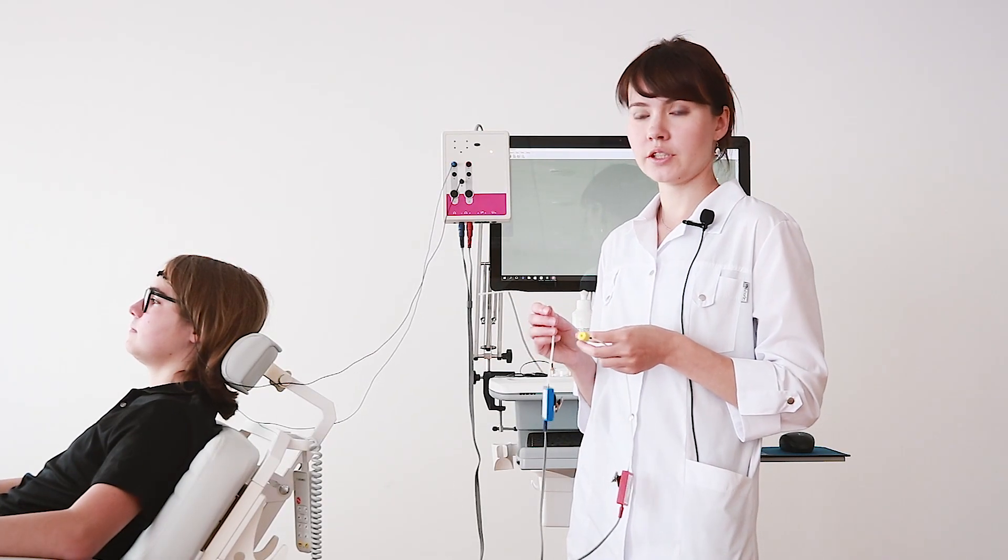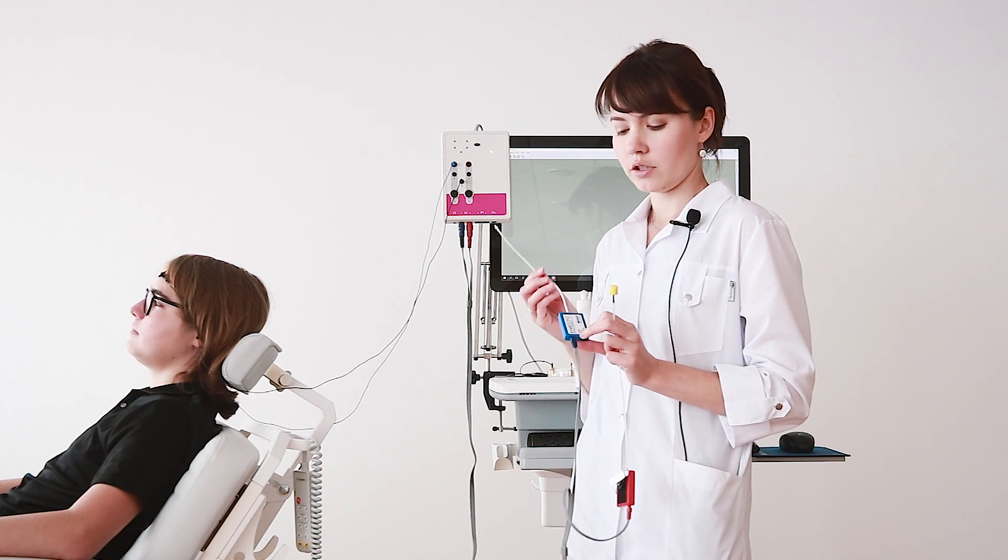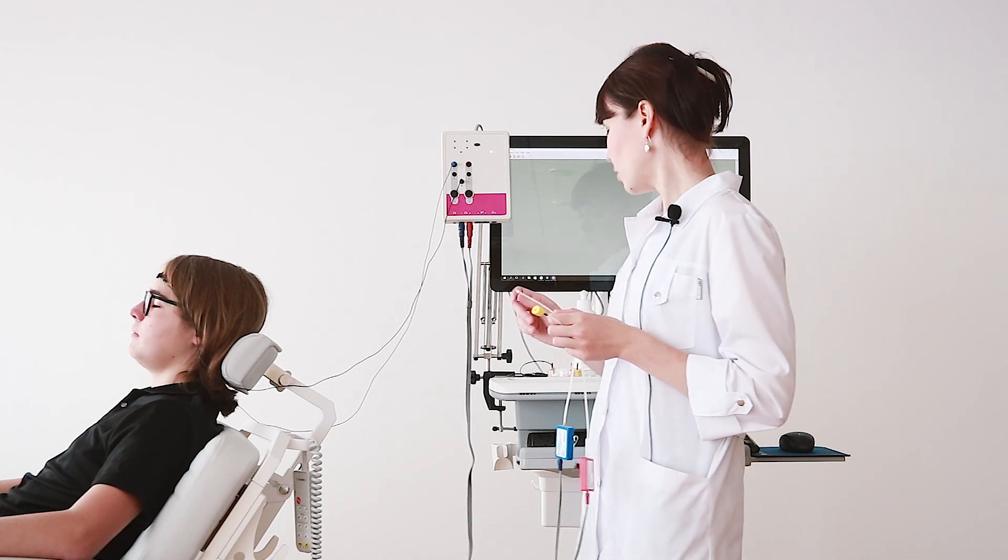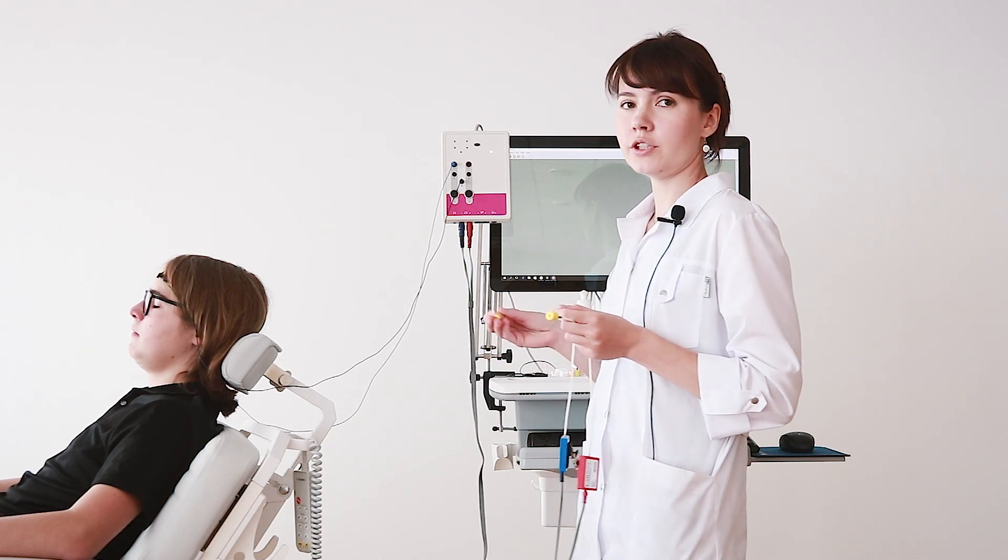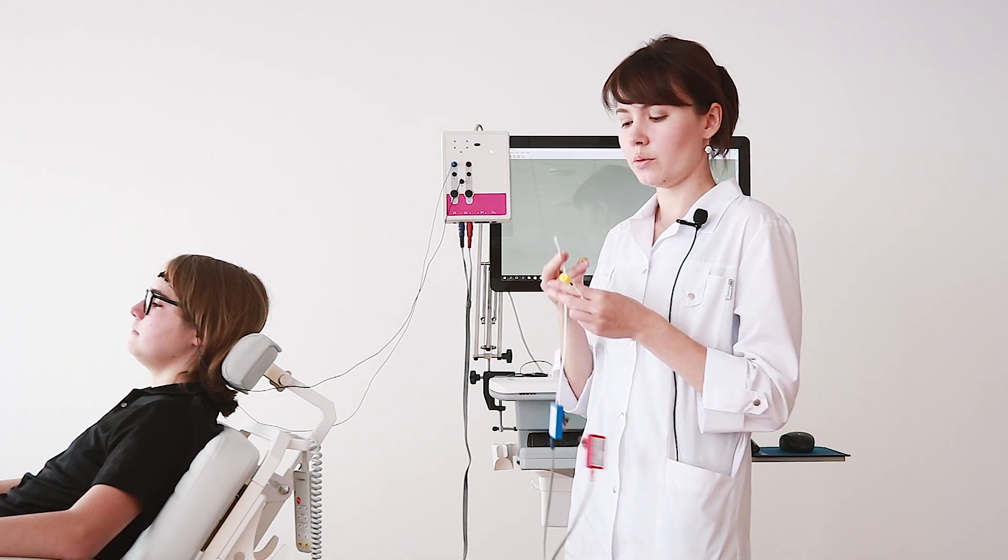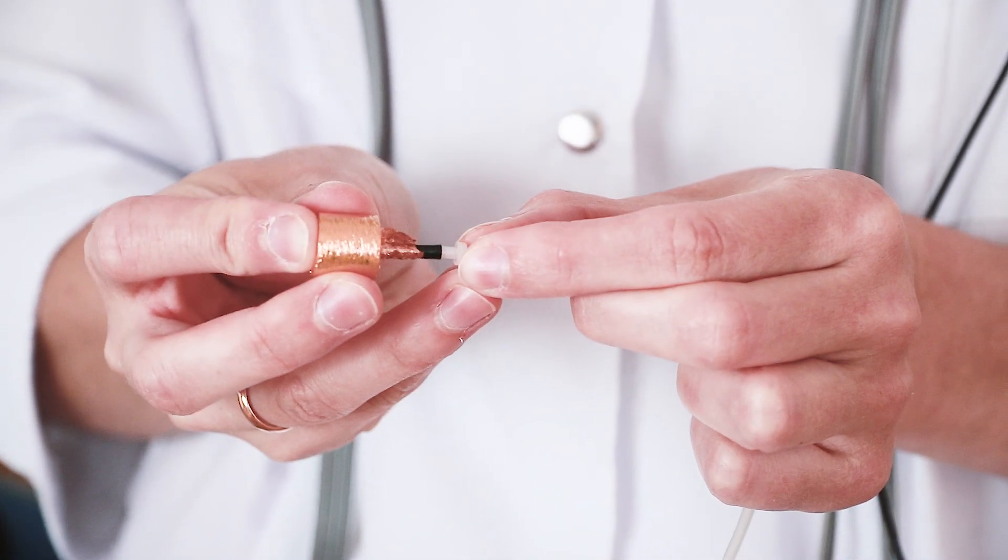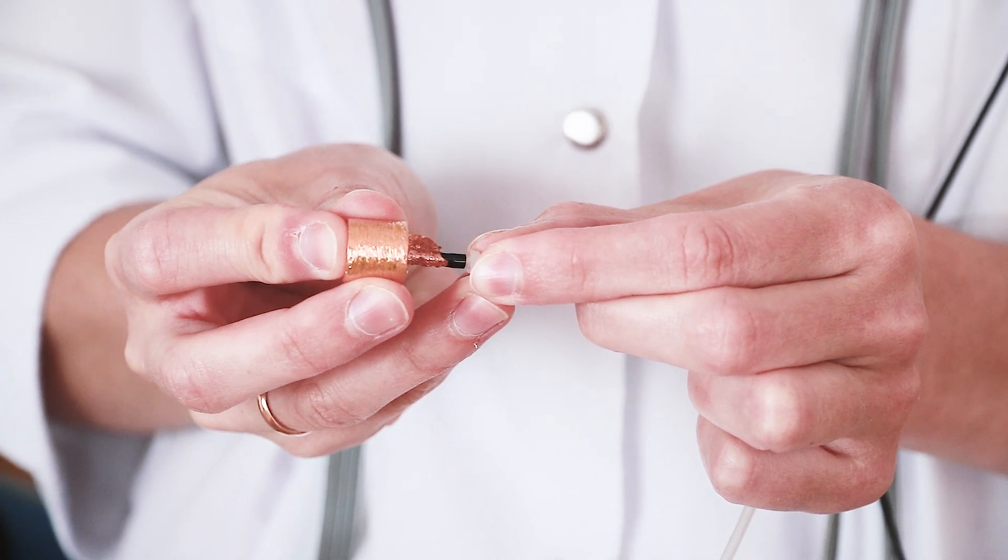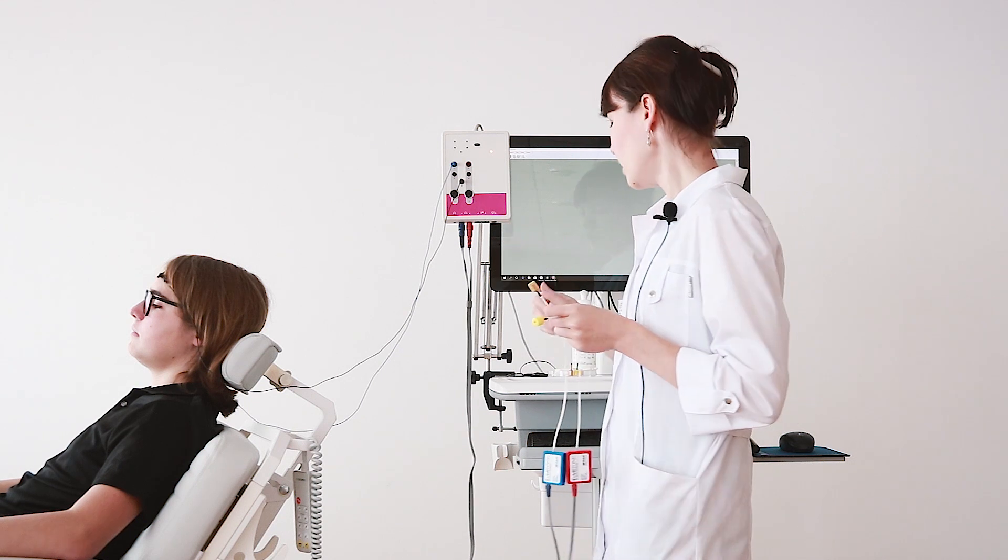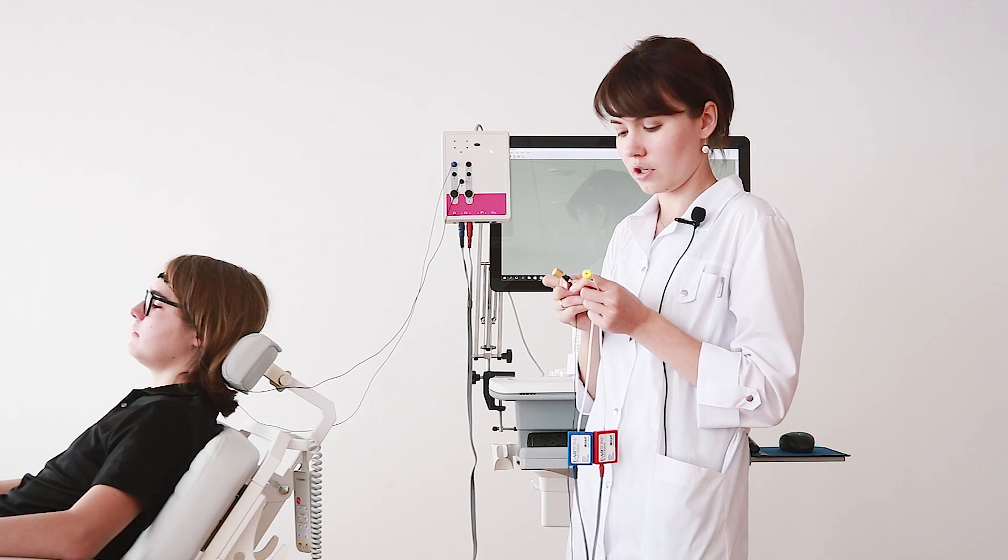In the electrocochleography test, we need to use a special type of auditory stimulator. As you can see, it is insert earphones. Because we will evaluate the state of the left ear, in the left part of our auditory stimulator we connect our active electrode tip-trode. To connect tip-trode to our amplifier, we will use a special alligator connector for cochleographic electrodes.